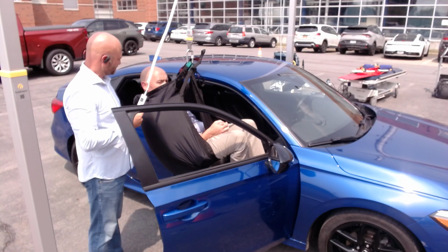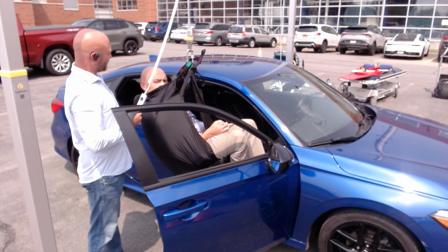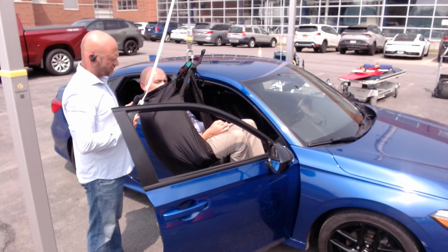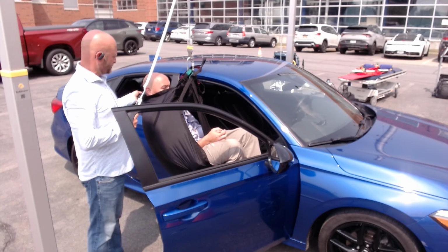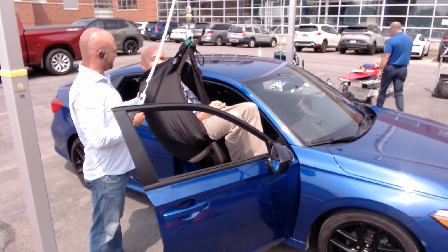So, yeah. I was just thinking about that slide. Actually, no. Can you grab that slide over? The red one, the big one. This really is the great tool.